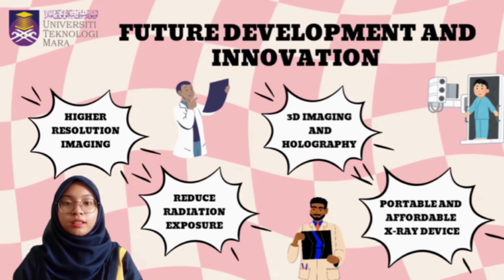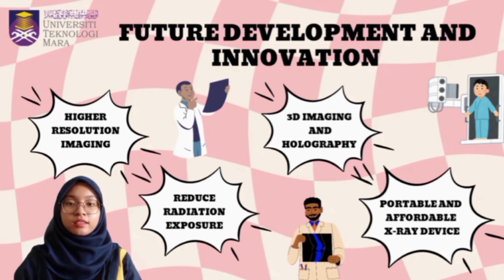Lastly, portable and affordable X-ray devices. The creation of smaller, more portable and cost-effective X-ray devices could increase accessibility, particularly in remote or under-resourced areas. This would enable broader use in various settings, from small clinics to disaster zones.